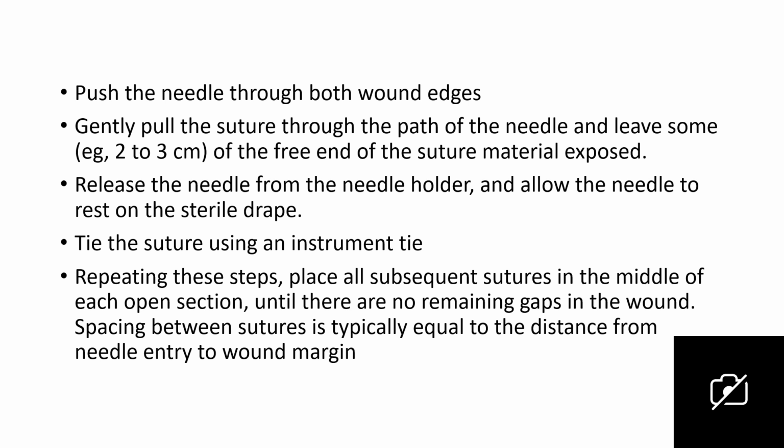Repeating these steps, place all subsequent sutures in the middle of each open section until there are no more remaining gaps in the wound. Spacing between sutures is typically equal to the distance from the needle entry to the wound margin.